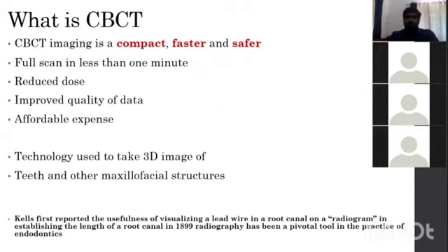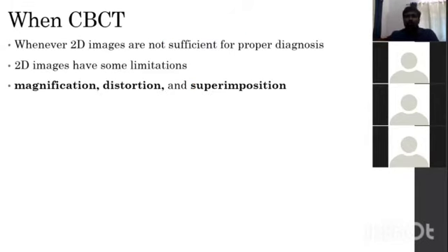Actually, there is evidence in the literature from 1899 onwards that radiology was used as a pivotal tool in the practice of endodontics. And the next question was when CBCT should be referred, or when CBCT should be taken.